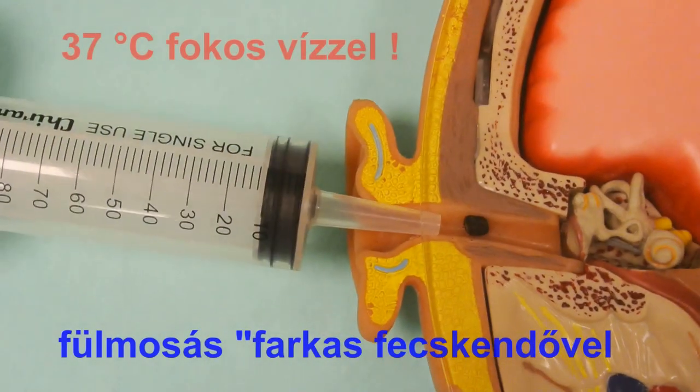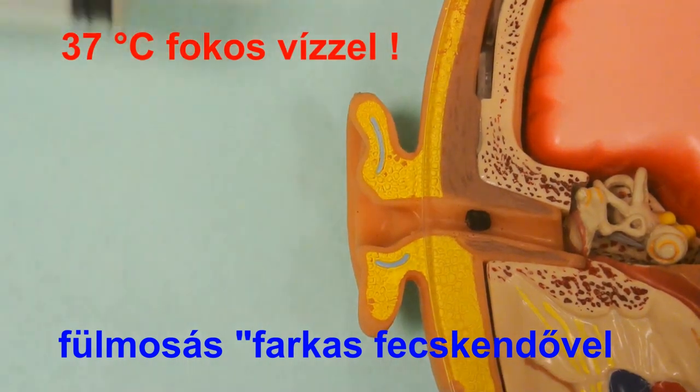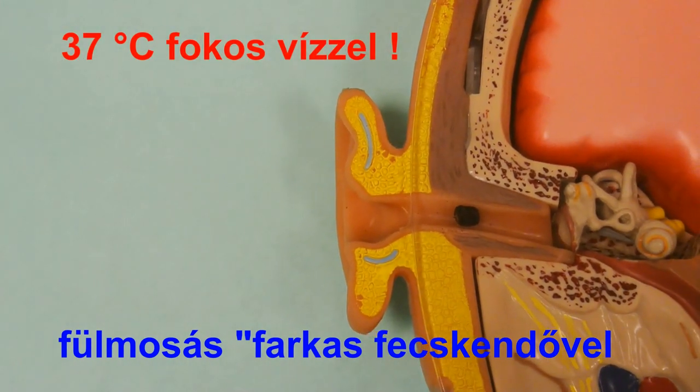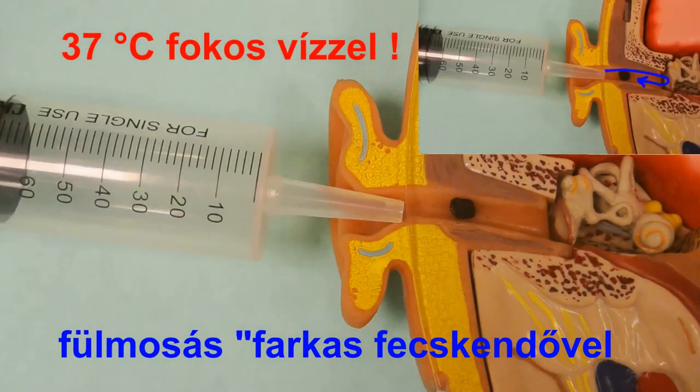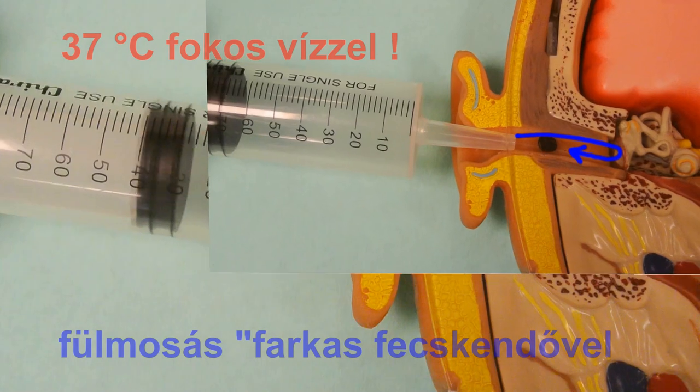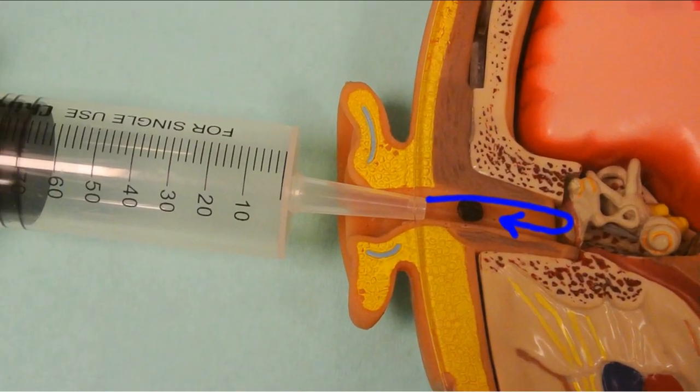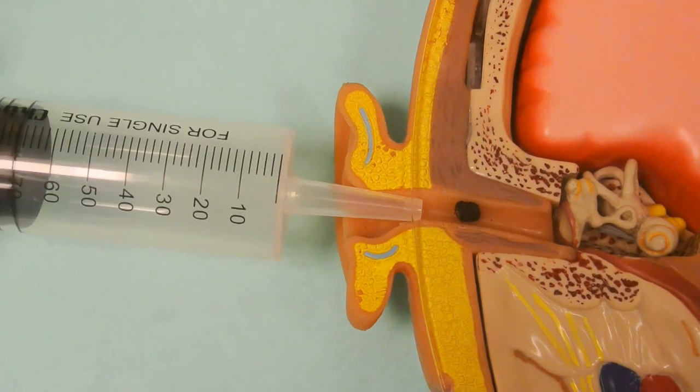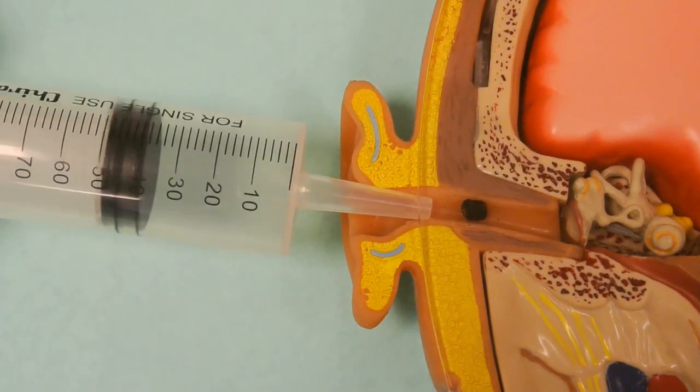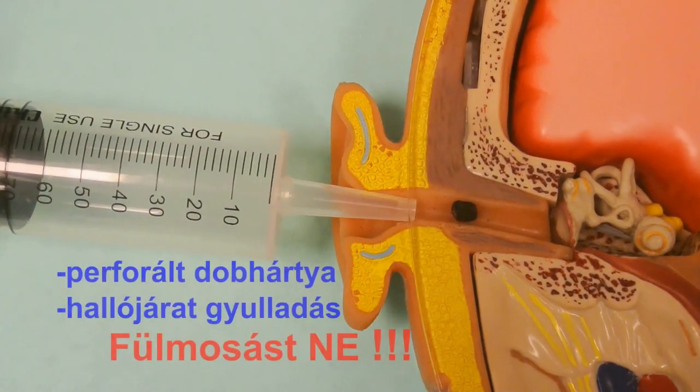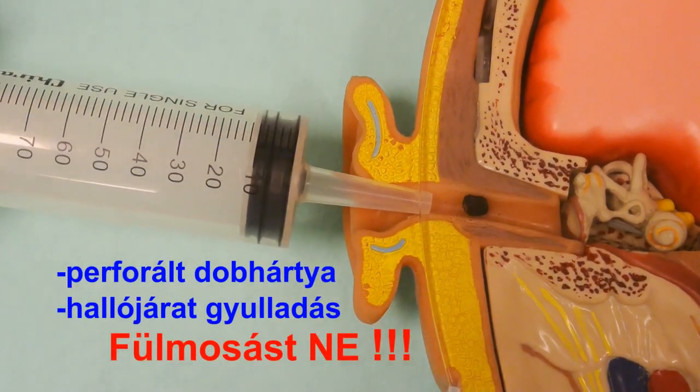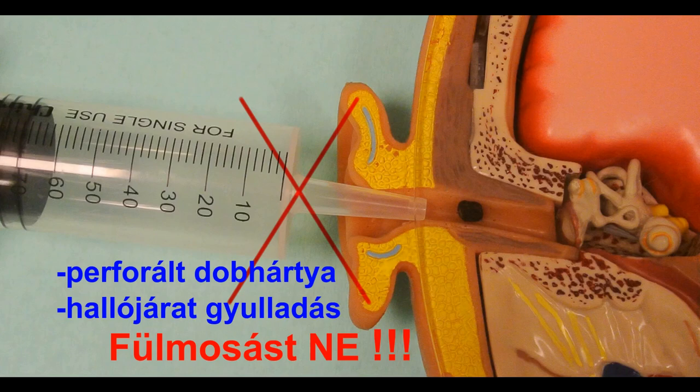Irrigation is also useful to remove foreign bodies. Use body-warm water to wash out the ear canal, and do not use irrigation in case of perforated eardrum or external otitis.